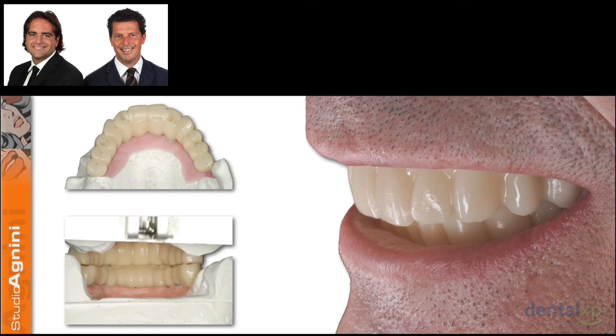And here we have our prototype that arrived in our office. We screw it in the patient's mouth. We try the function of the patient. Remember that we want to go for a monolithic zirconia, especially in the posterior area, and we want to try the function in the mouth before sending everything to the milling center.